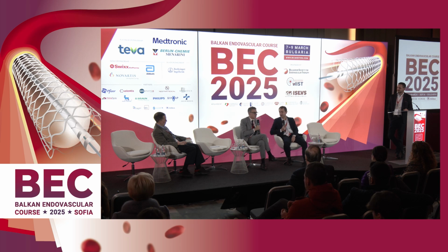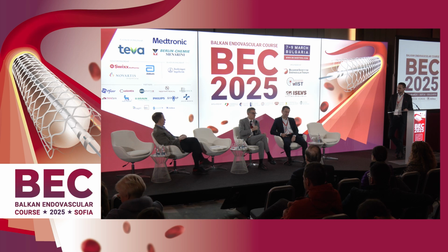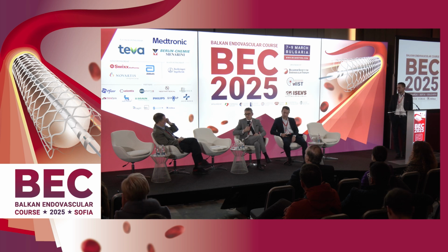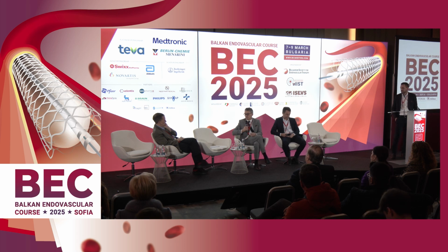Exactly, and because of that, everybody has to calculate all these things during the planning in order to avoid late complications and late interventional procedures. Professor Stankov will show you, but the secondary procedures regarding endoleaks and late migration are very difficult to correct. So it's putting stents, plugs, stent grafts, coils. And speaking about reimbursement, the specific coils reimbursement in Bulgaria is very limited, and it can reach some co-payment that is not affordable. All these anatomical cases are very expensive. Dr. Criado mentioned already how much it can reach in a rich country like the US.